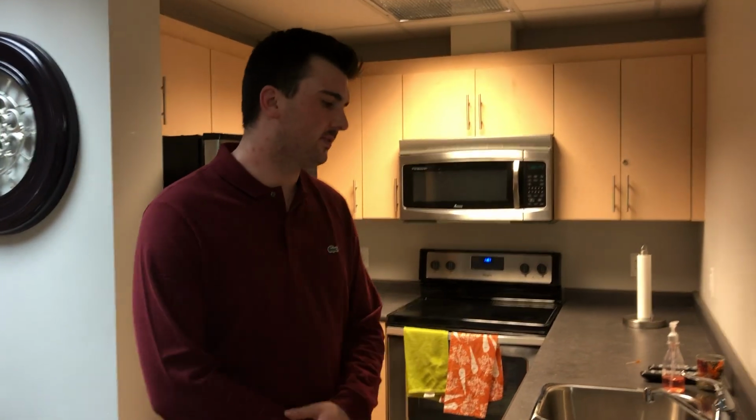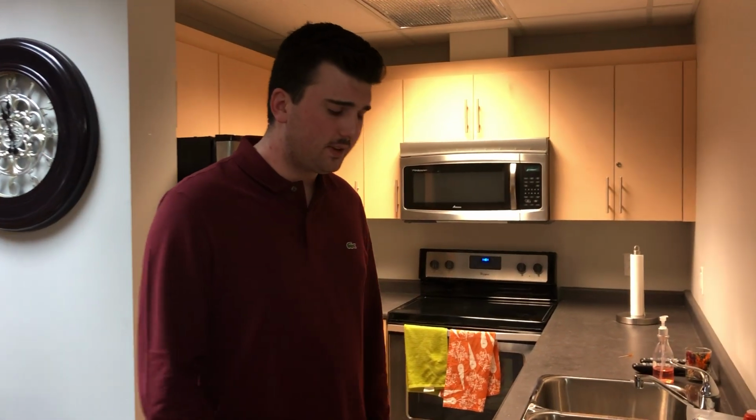So first, I've already checked the physician's order, and a dressing change is due for this patient at some point today, so I'm going to do it now. I've already entered the patient's room with all my supplies I've gathered from the supply closet, and I have already explained the procedure to the patient. I told them that I'm going to be removing the gauze and the Jelonet and the Mefix, and I'm going to be cleansing the site with normal saline, drying it off and putting a fresh new dressing on top of it. He's consented to the procedure, he understands the benefits and the risks of it. And I've identified the patient using 2 patient identifiers with his armband, and he's verbally responded to them and confirmed them.